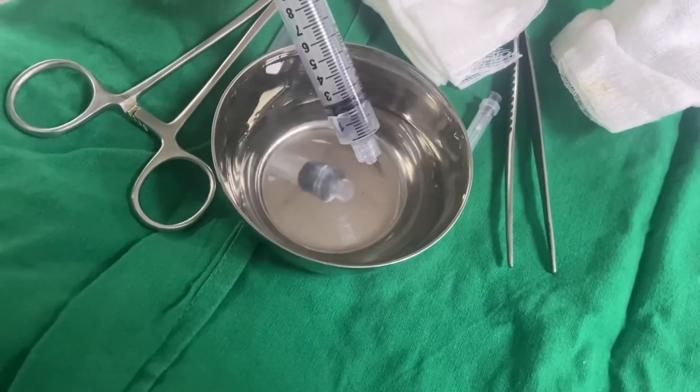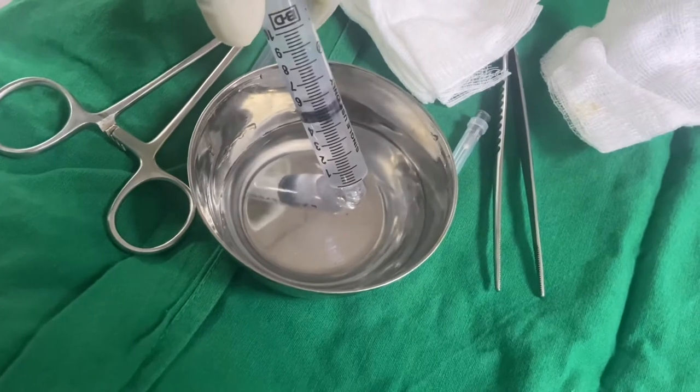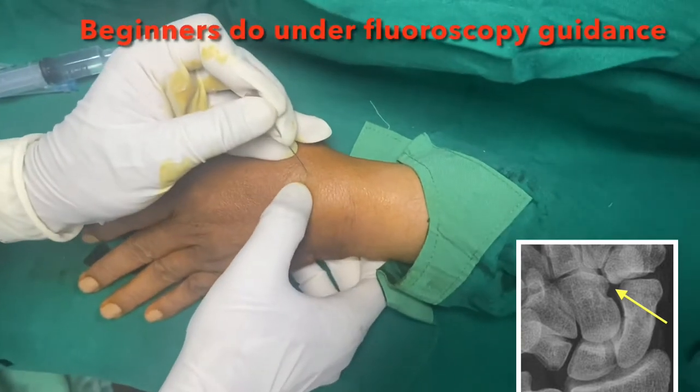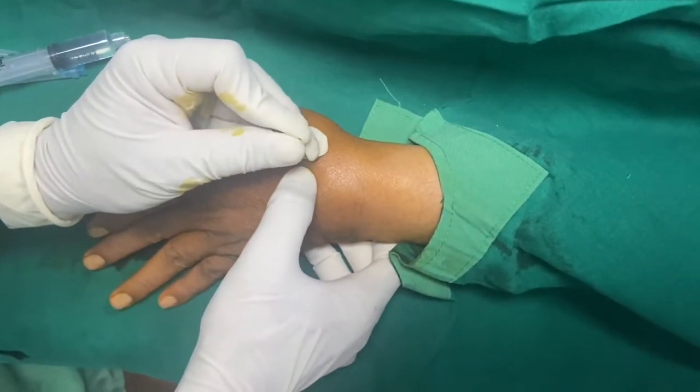This is normal saline — make this solution 5 ml. This is the first injection we are going to give in the radioscaphoid space. You can feel this space.